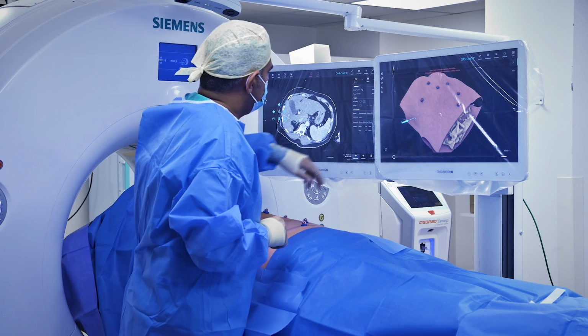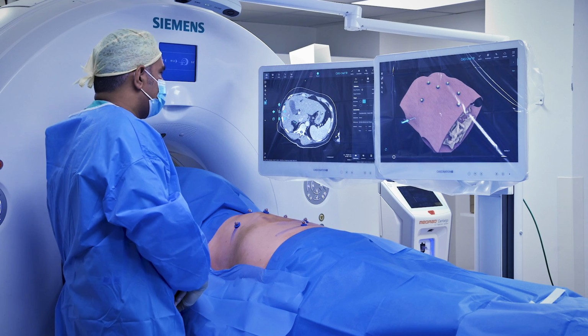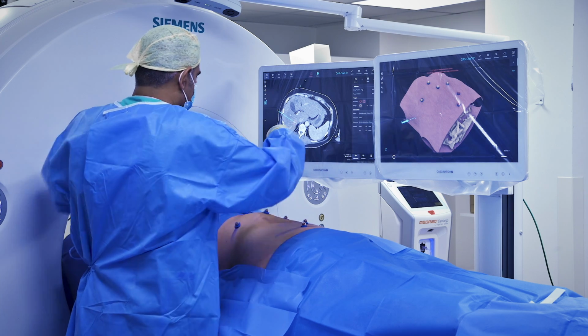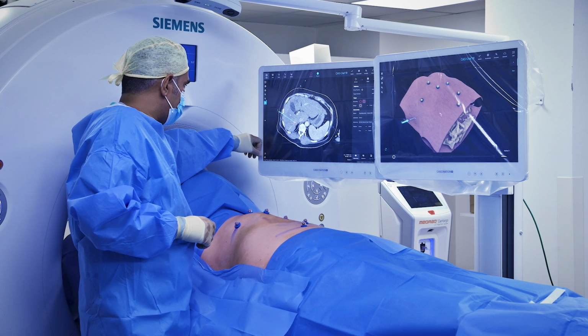Using the auto segmentation process, the tumour will be segmented. In the meantime, what we'll be looking to do is to pick our selection probe.